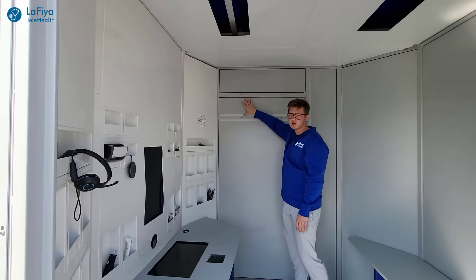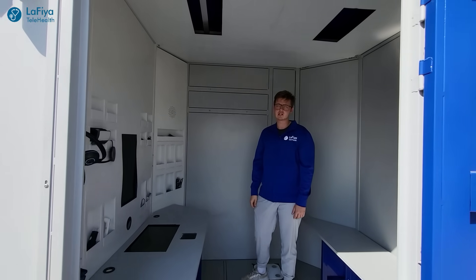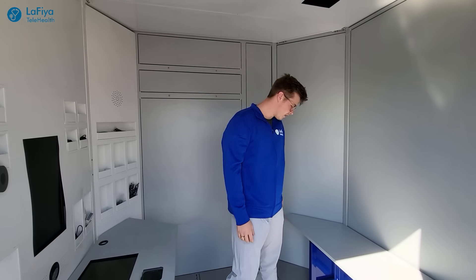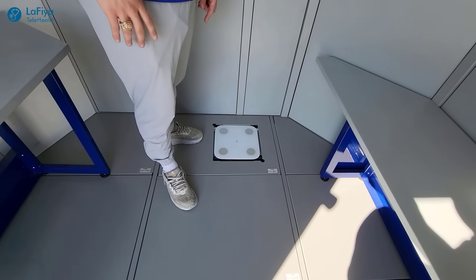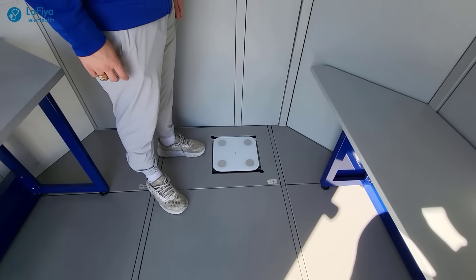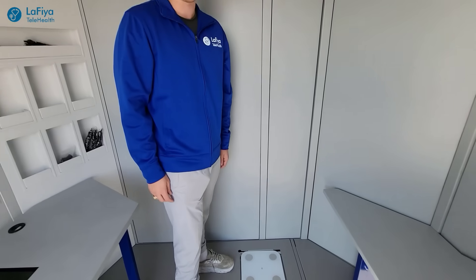With the AC unit here, the patient is able to remain comfortable in whatever weather conditions they might encounter wherever this medical kiosk is located. There is also a scale — the patient will step onto it, and it is connected to the LaFiya TeleHealth software so the doctor is able to see the patient's weight and current physical condition.